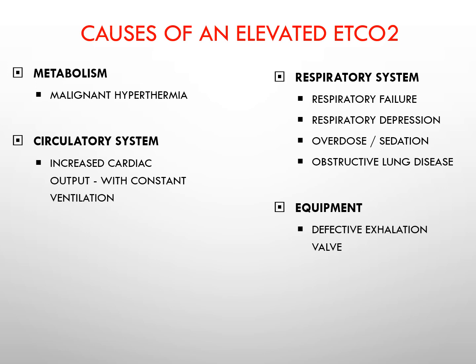And there's always the chance that there's equipment failure. So a defective exhalation valve on, let's say, a single limb circuit. We don't see them real often. We do see single limb circuits used with certain BiPAP setups, non-invasive setups. For instance, the Trilogy ventilator / BiPAP can use a single limb circuit, and that exhalation valve can become defective, or secretions could clog it up, something along those lines, which could absolutely cause the patient to rebreathe CO2, with an elevated capnographic waveform and numeric value.